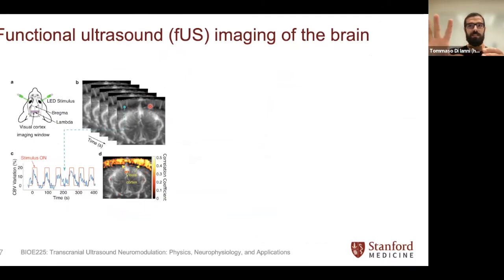I understand that. I guess what I'm asking is there's cortex up at the top. This is the cortex up here. Then we have white matter here in between. So it's less vascularized. Okay. Then the cortex kind of wraps around in this part of the brain.